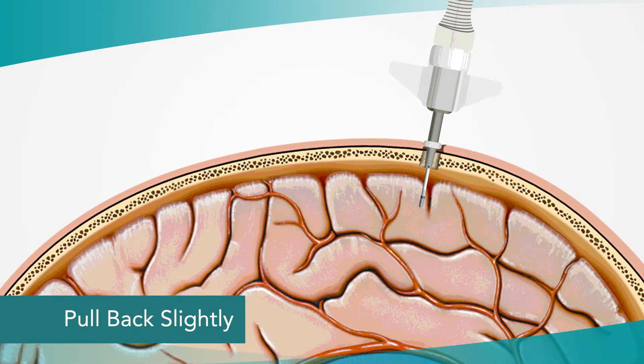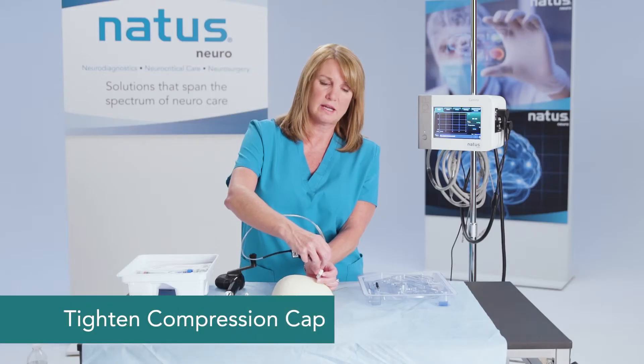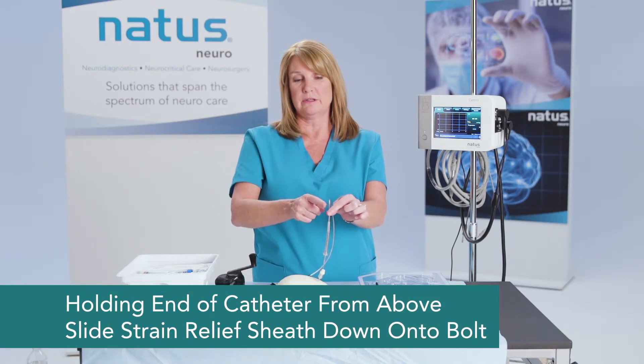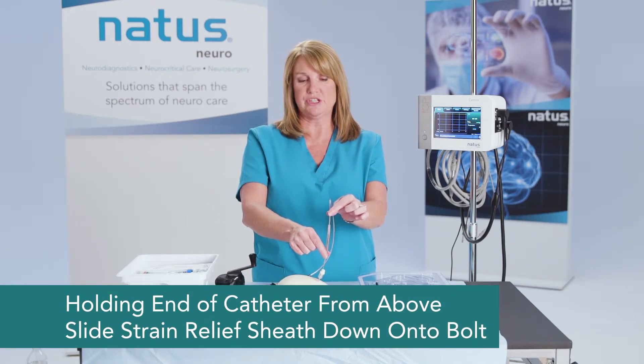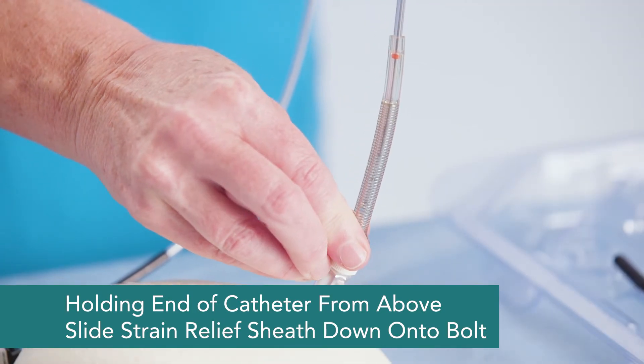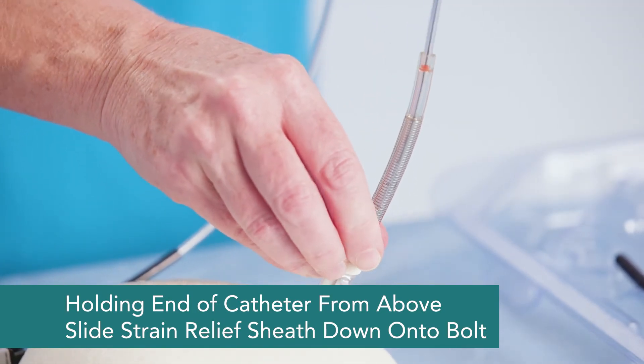Pull back slightly — just a couple of millimeters — then tighten the compression cap. Hold above the strain relief sheath, keep it taut, and snap the strain relief sheath down onto the bolt itself.